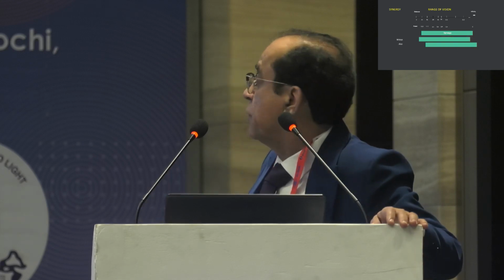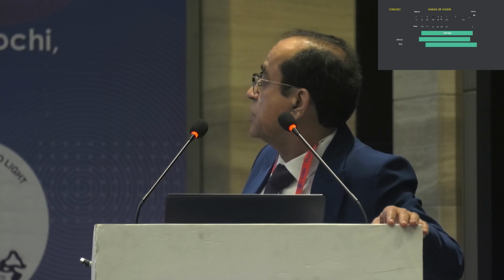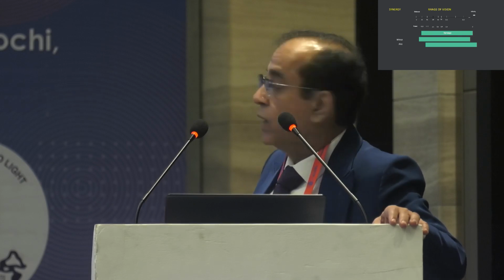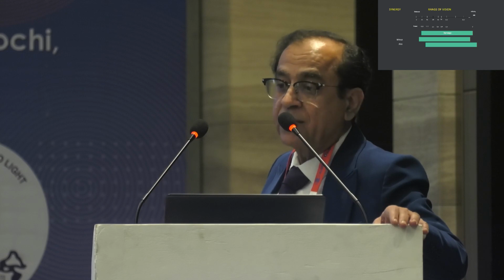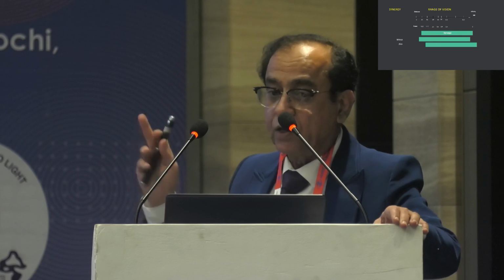So now if you want to use the synergy lens, this is covering infinity to 33 centimeter. If the patient becomes myopic, this 33 centimeter becomes 25 centimeter, which will be very uncomfortable for the patient, and he will miss out on the distance vision. So rather, if you want to err with this synergy lens, the patient should shift on this side. If it becomes plus 0.25, he is still seeing clear for distance, and his reading distance becomes a little more, which will be more comfortable. So if you are using synergy lens or the high power lenses, it could be a little plus, but not on the minus side.